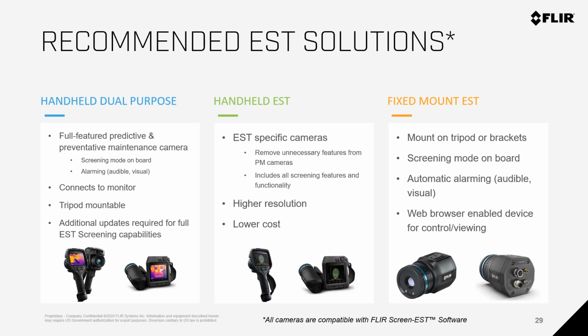When you have the automatic ones, they're going to take all the temperatures, they'll screen those in, except for the ones that are too high, the ones that are above the alarm. And then with the automatic ones, you're going to be consistently updating that reference, or that average temperature. So even if you have, like a roulette table, right? Even if you have a run of red, red, red, red, red, eventually you're going to get some blacks that are going to normalize that back down and give you a pretty good average of everybody in that environment. So you can manually include or exclude the temperatures that you want. And if you have the automatic ones, you'll get so many samples that one high one here or one low one here really isn't going to move your average that drastically.